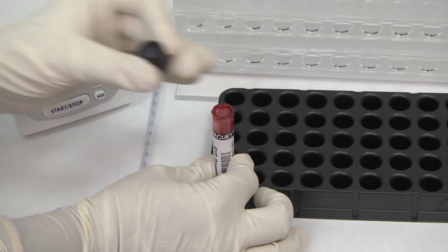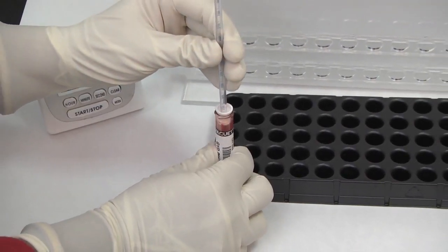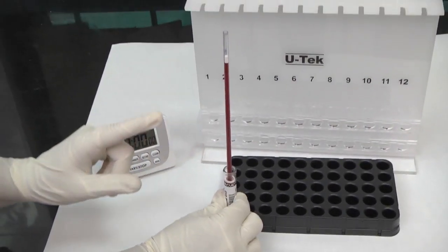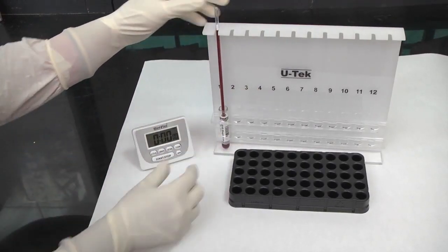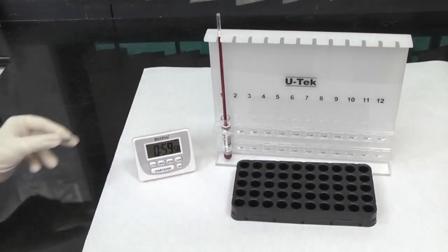Open the vacutainer gently. The sedimentation pipette is inserted into the tube right to the bottom of it. The mixture is thus forced upwards, and due to the zeroing system, the column falls exactly to the 0 mm position. Place the tube with the pipette into the stand provided, maintaining the serial number of the samples. Set the timer for 1 hour.